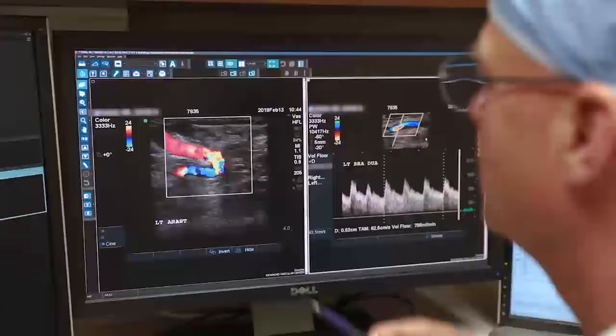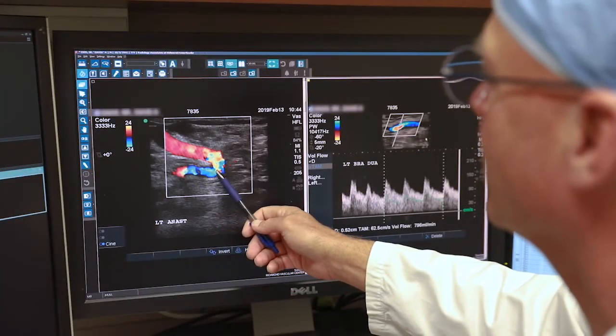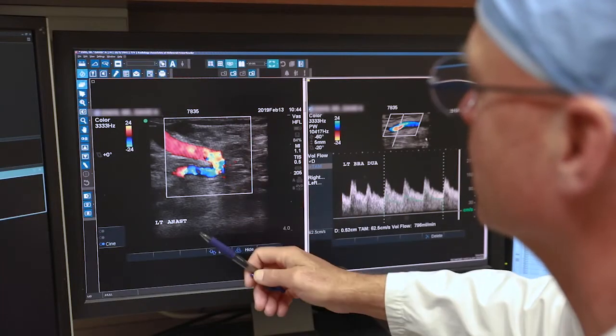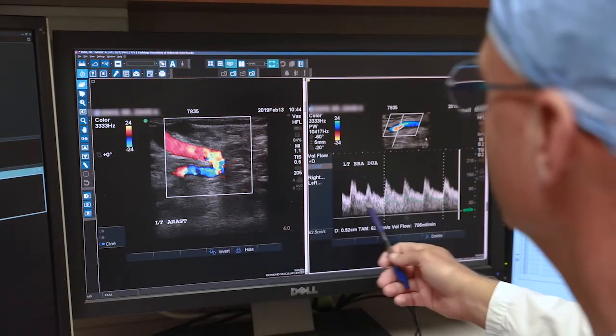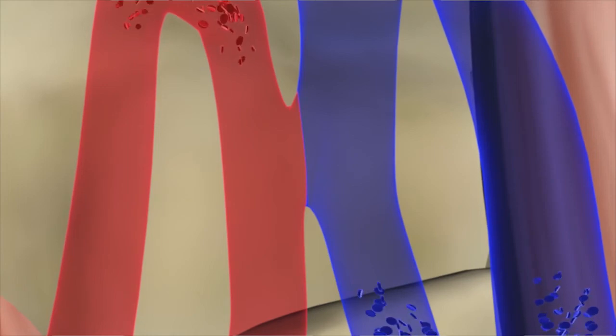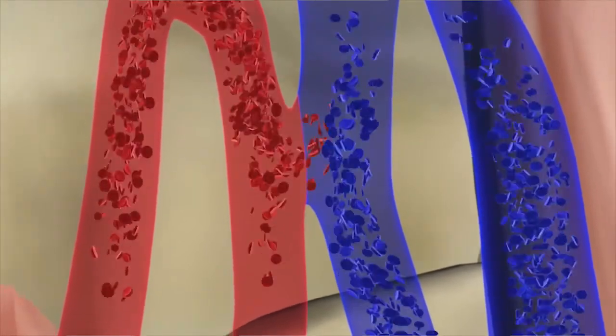What this paper does is it describes in great detail the physical exam and the ultrasound findings of patients who successfully achieved this milestone of 2-needle cannulation. And so now when a doctor is perhaps for the first time creating this type of fistula and they're wondering, gee, is this patient going to be ready for 2-needle cannulation? This paper gives them those numbers so they can figure that out.